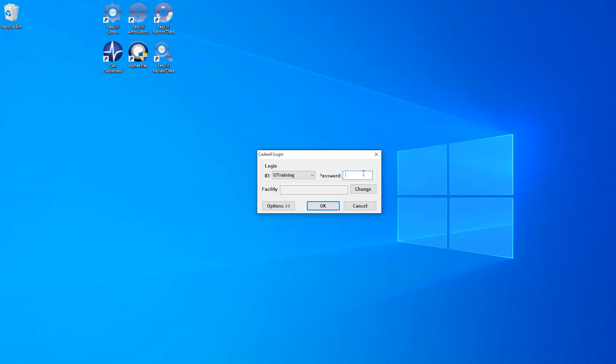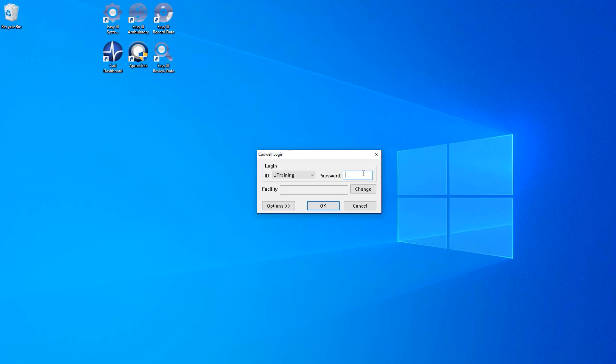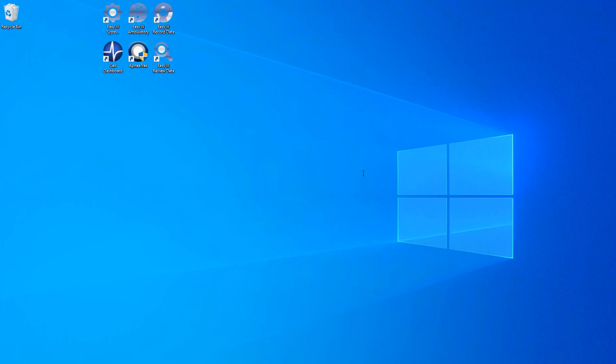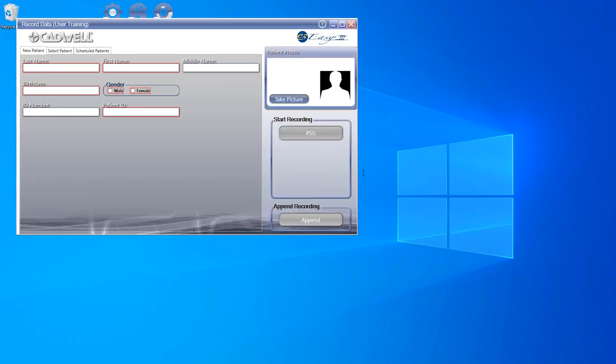Depending on your location, this dashboard may launch on its own, meaning your Windows login credentials have been used to securely log you into the EZ3 application, or you may need to use an assigned CADWL login.